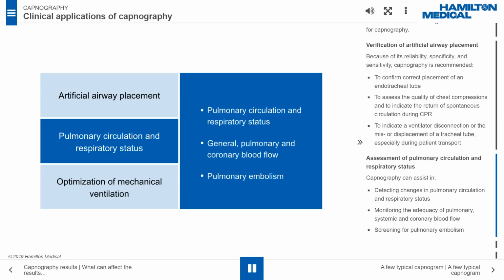Assessment of pulmonary circulation and respiratory status. Capnography can assist in detecting changes in pulmonary circulation and respiratory status, monitoring the adequacy of pulmonary, systemic and coronary blood flow, screening for pulmonary embolism.